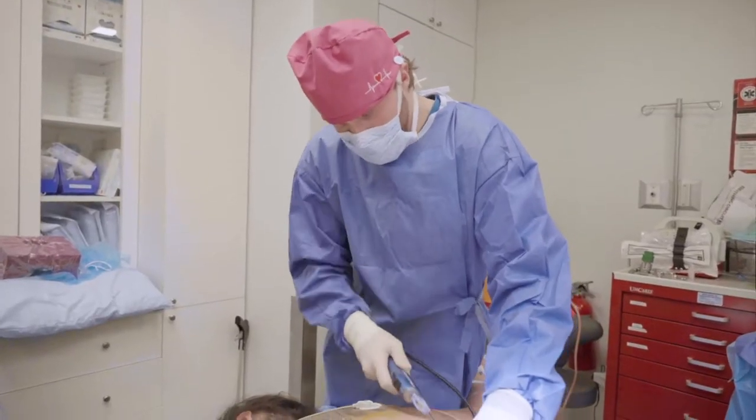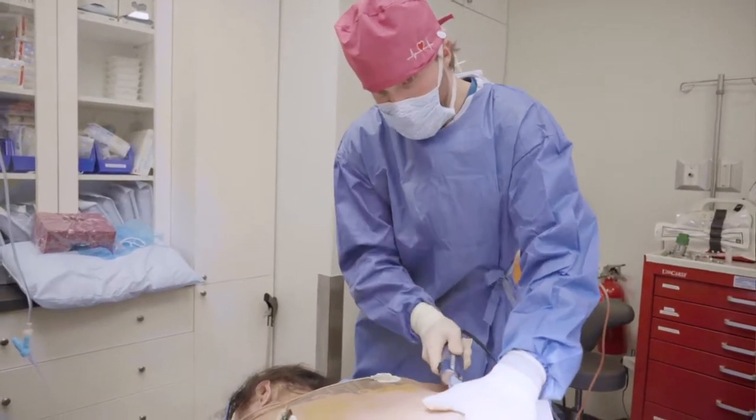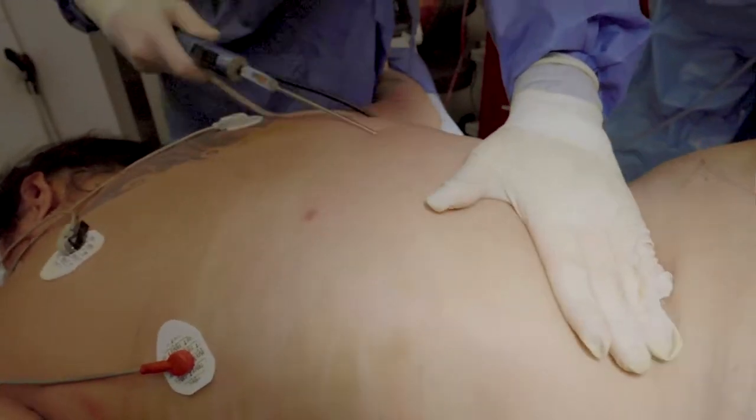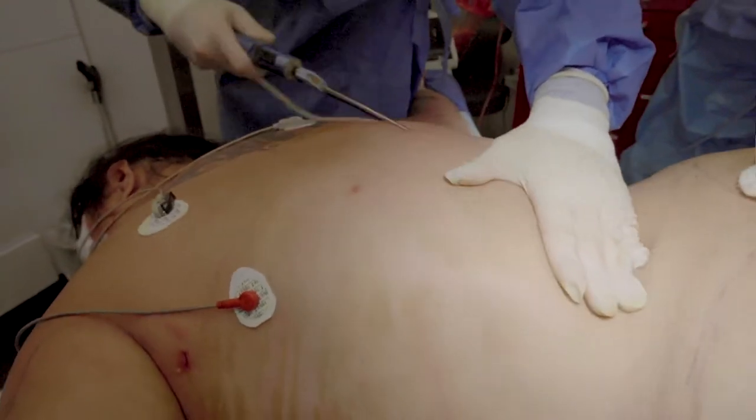I'm using her old incisions because I don't want to make new incisions — I don't want to give any new scars. I usually make one over here, but she had two, so I'm using those two she had previously.